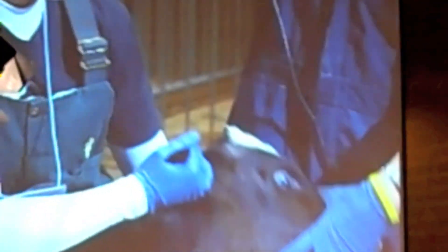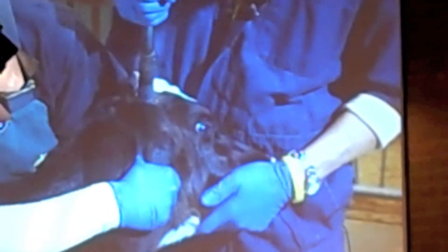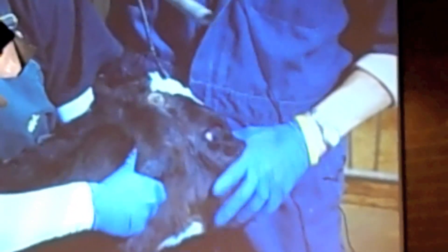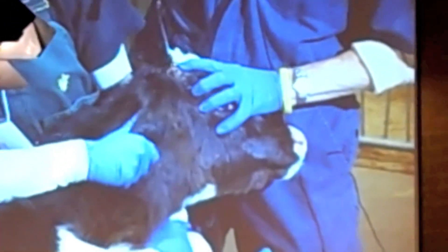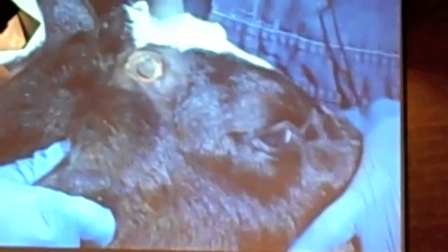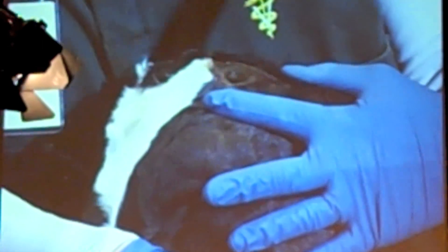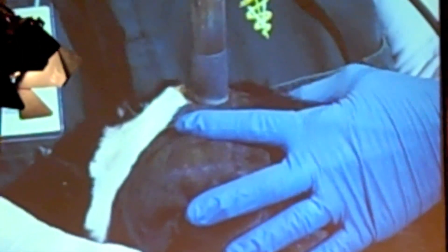I'm going to do this side now with another slow five-count, being careful not to burn Mindy. We should see that red ring — I see one spot where the red ring isn't complete, so I want to make sure I don't get regrowth. I get the front part of that horn bud again. Now I can see the white. I didn't do a very good job because I didn't want to burn Mindy — good excuse, right?